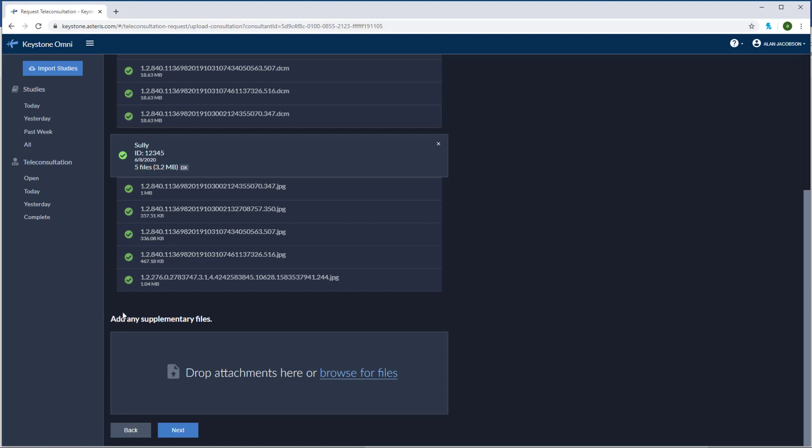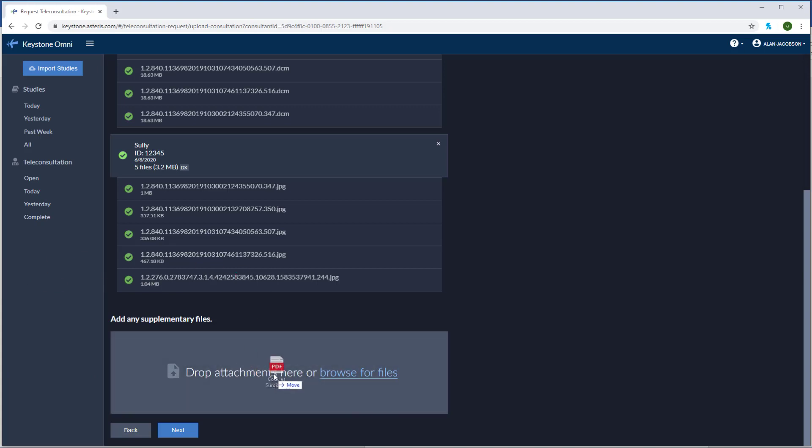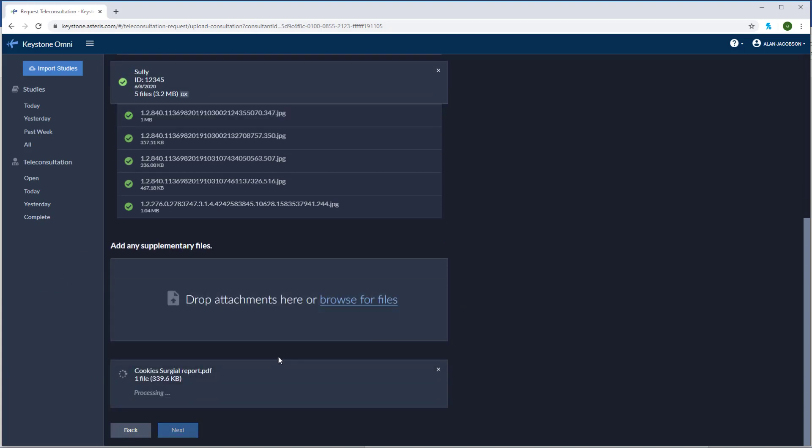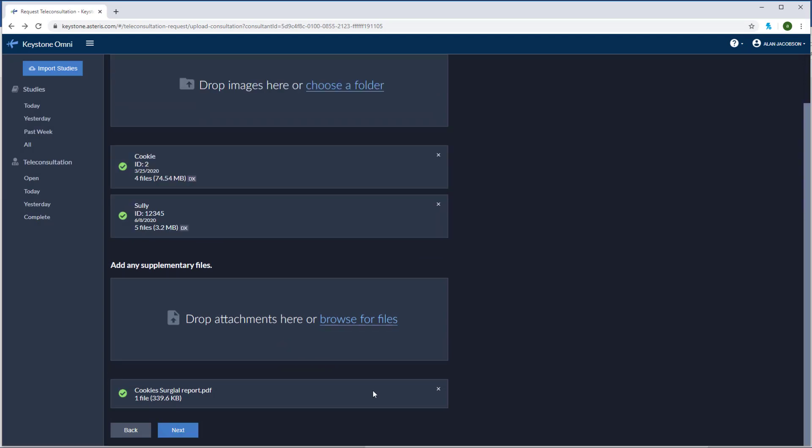Now below the image upload you have add any supplementary files. These files can be added and those include surgical reports, short video clips, or even procedure photographs. This section is meant to provide any supplemental documentation that will help the consultant with their interpretation. I'm going to go ahead and add cookie's surgical report here and I'm just going to drag and drop a PDF file. Supplementary files are not required to make a submission. Once you've got your images and any additional files that you want to add, go ahead and click next to start your submission.